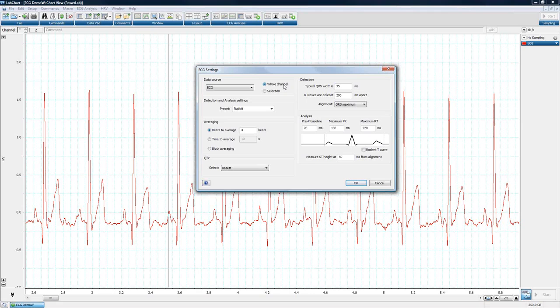Do I want to analyze this whole channel, or do I want to analyze a specific selection? For this file, it's very short. Analyzing the whole channel will be relatively easy. It won't really bog down the computer. If you have many hours of ECG data that you're trying to analyze, it might be helpful to only analyze a specific selection, and I'll show you how to do that later on, just to keep the system load on the computer down. Over to the right-hand side, we start talking about how we detect QRS complexes, how we find each individual ECG event, each beat.